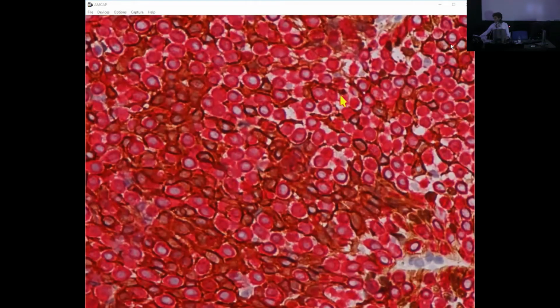You see the rounding up of the cells really stands out with this staining. So I'm becoming more proficient in the use of this staining for the diagnosis of lobular neoplasia. It does correlate. And actually, in the past, I think Dr. Tavassoli had reported how CK18 was useful as a marker of lobular neoplasia.